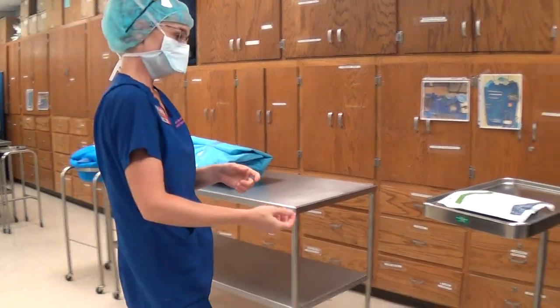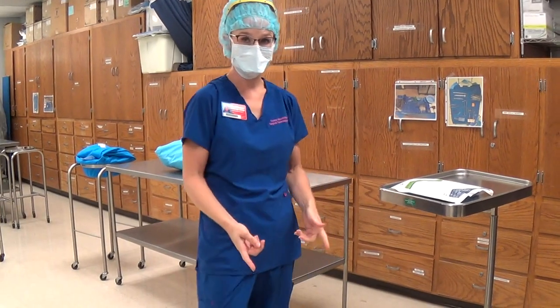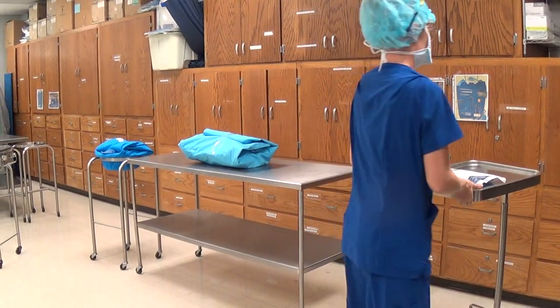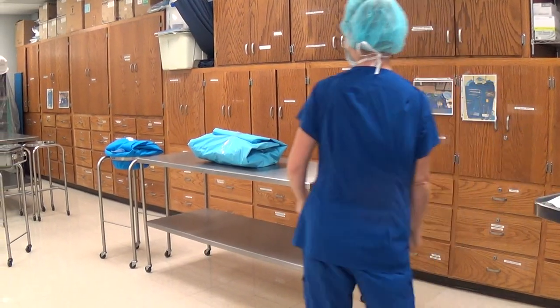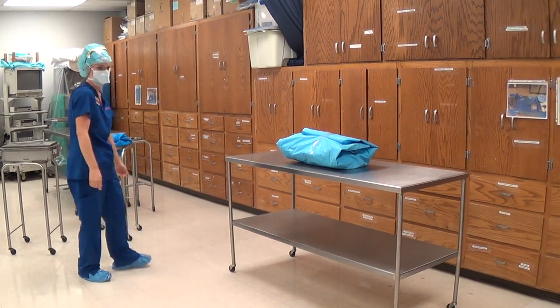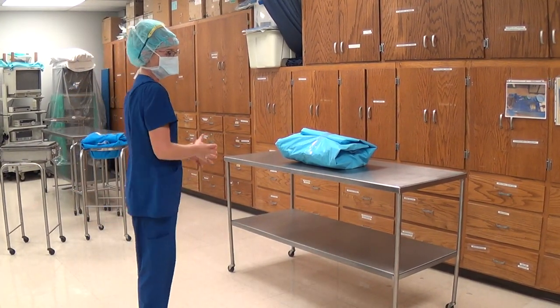First thing, Casey would have done her medical hand wash and properly put on all of her OR attire. First thing Casey is going to do is give herself room before she opens everything in her operating room. She has created plenty of space around her back table.